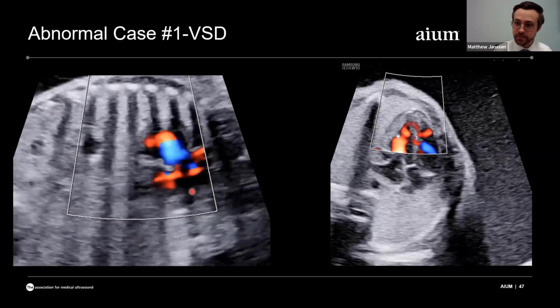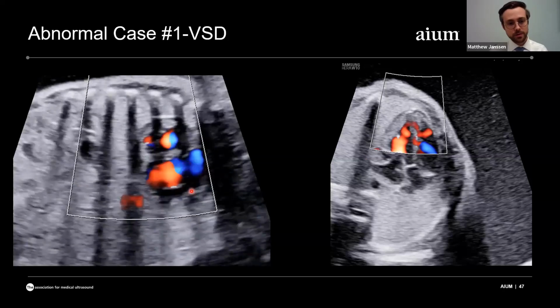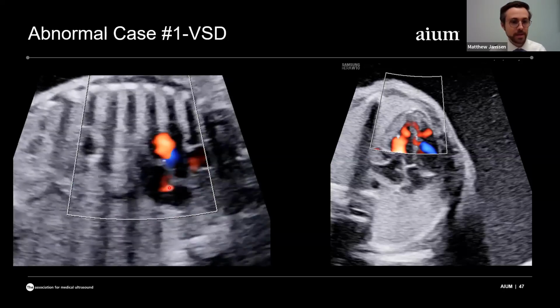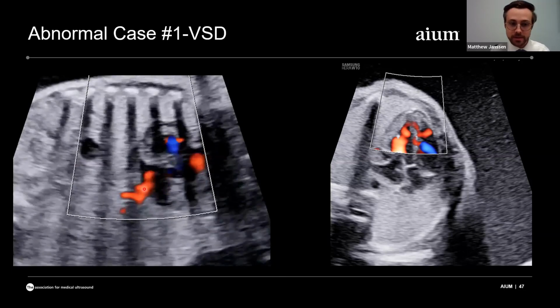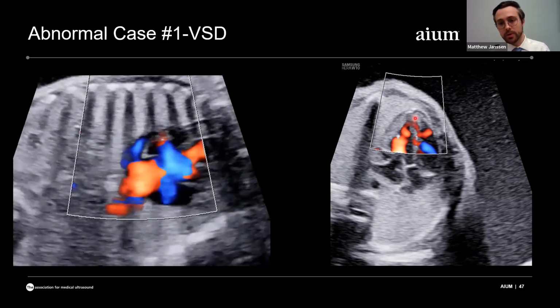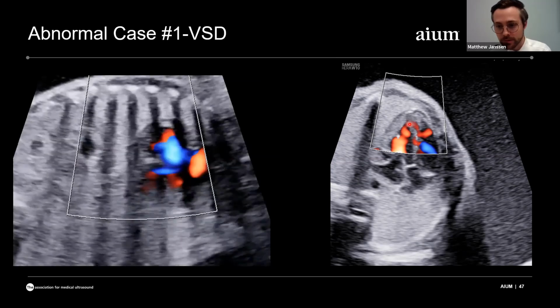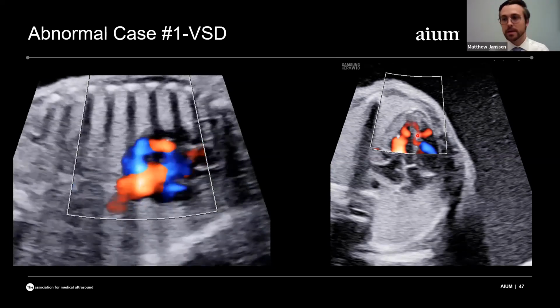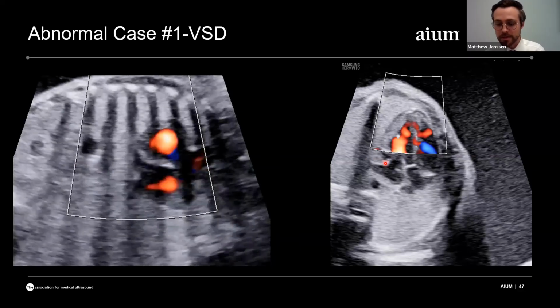And so certainly in this same fetus from the same case, on further evaluation with the short axis showing color Doppler flow here on the left, we did see evidence of maybe a VSD. And certainly with this more apical 4-chamber on the right, we see this color flow crossing the septum. And surely enough, we did find a very small muscular VSD in this fetus as well.